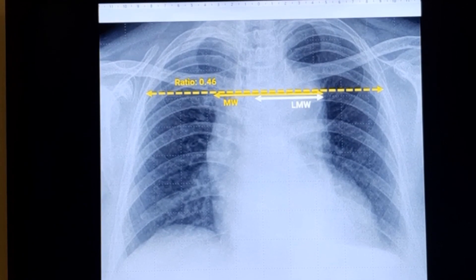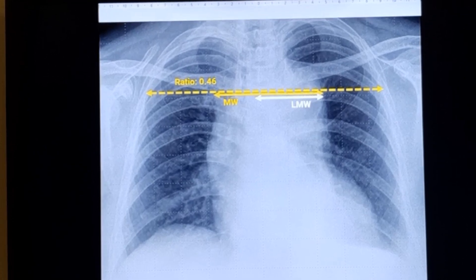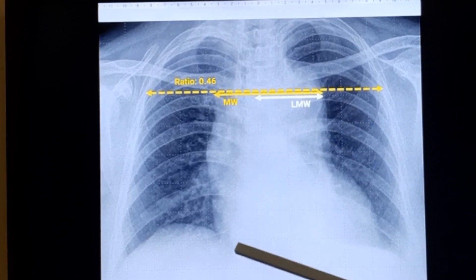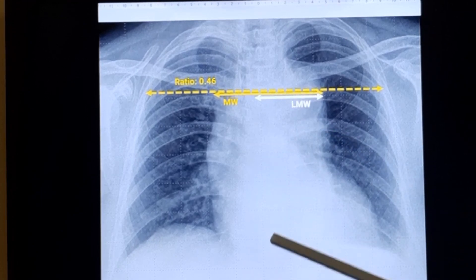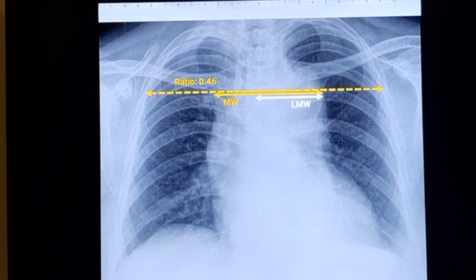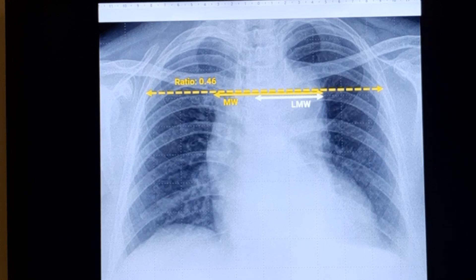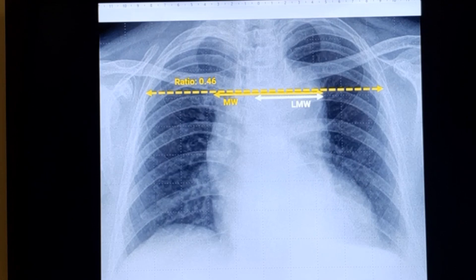From an academic point of view, these are some of the measurements which can be taken from a chest x-ray. In this case, I have taken the measurements using a grid and ruler in a PowerPoint presentation, because there is a limitation — all are digital x-rays now. The size of the x-ray you get is not like the old size; it is often smaller and you are seeing it only on the computer screen, where measurements can be taken. Otherwise, if you get a printed x-ray, it is difficult to take measurements because it will not be standard with the old teaching.